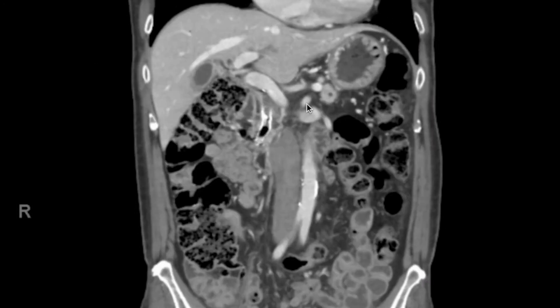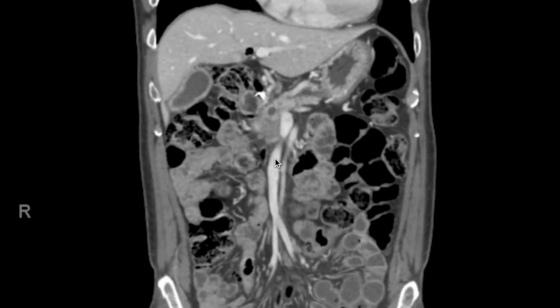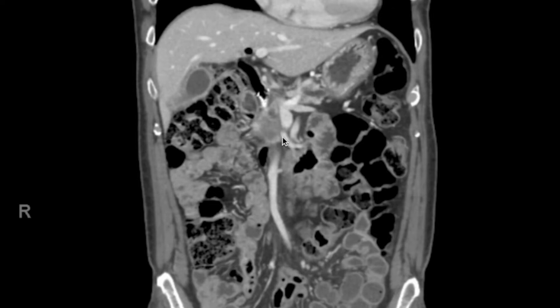In the next case, we will demonstrate the approach to the superior mesenteric artery when the tumor appears inseparable from the portal vein and superior mesenteric vein, thereby limiting retraction of the vein to the patient's left. In this scenario, the vein may be retracted to the patient's right en bloc with the specimen. In this patient's CT scan, the tumor in the head of the pancreas closely approximates the superior mesenteric vein, suggesting likely adherence. The soft tissue between the uncinate process and the lateral border of the superior mesenteric artery appears free of gross disease. The first jejunal vein courses posterior to the superior mesenteric artery and may effectively be used as a landmark for the caudal aspect of the superior mesenteric artery dissection.